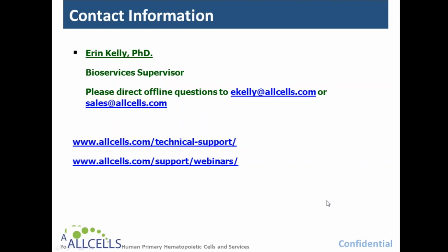So that's a question we get frequently here. Although we haven't done that direct experiment in-house, we do have a lot of customers who've done those experiments, and they report back that the results are similar. The literature is consistent with that. If you look up, people have compared fresh and frozen PBMNCs, for example, for a standard response to a strong stimulus such as lipopolysaccharide, it's recognized that the response may be dulled, but that the relative difference between donors is maintained. So I hope that helps answer your question.